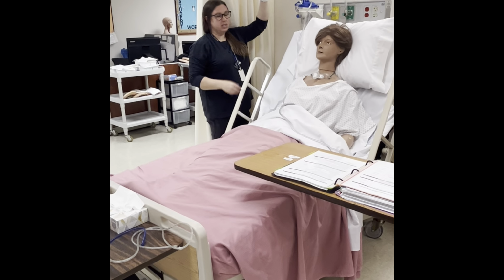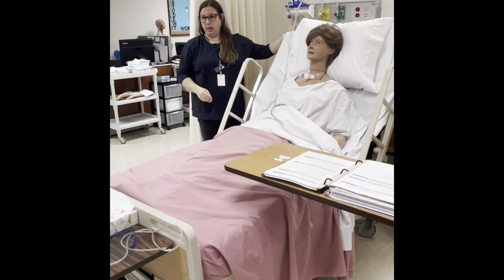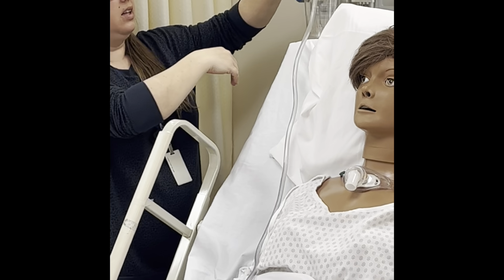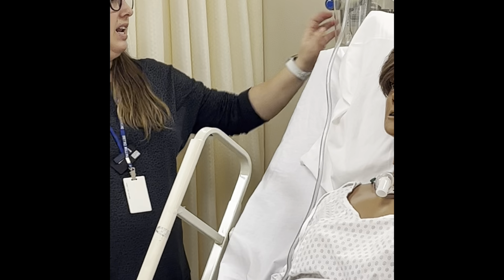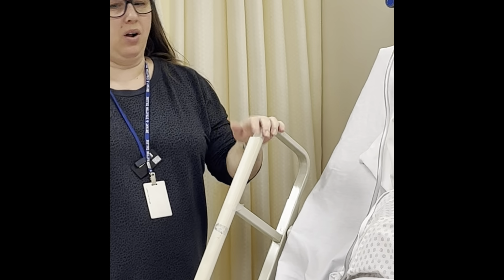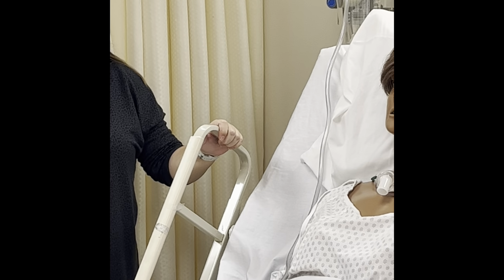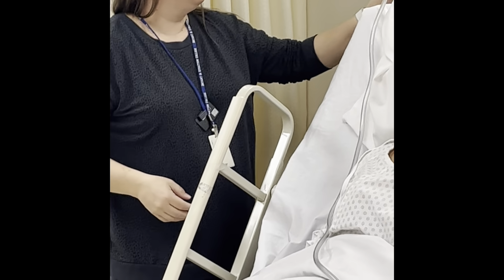And then we have this top tube that goes into the bottom of it, and it should always be to a canister. Why? Because we want the stuff to go into the canister, right? So sometimes they have this, and then a lot of places they'll have an insert in it, so you could take the insert out and get, not this actual hard one. It's like a soft plastic that you put on the inside. I always think of it as like a crock pot with a crock pot liner, because you just want to protect it.